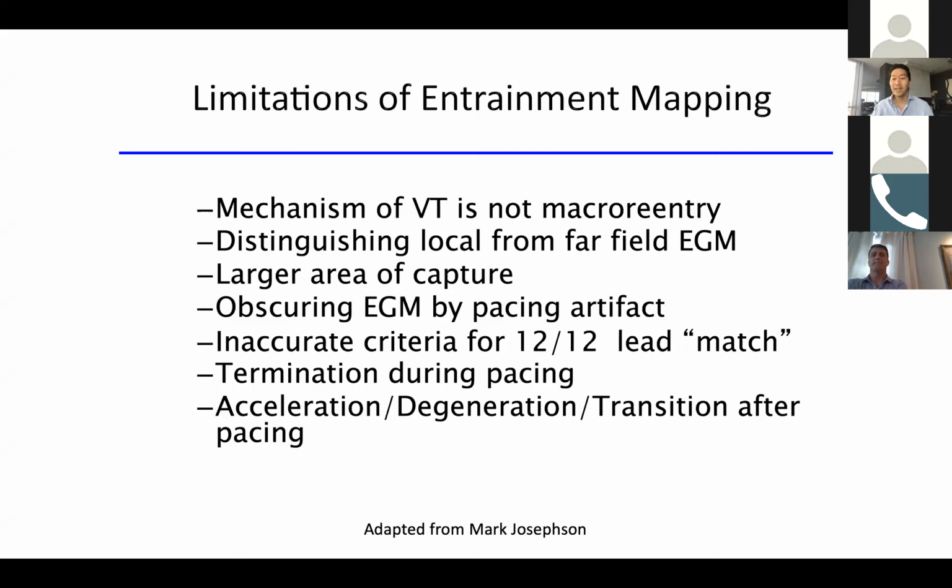In general, we don't typically pace at 2 or 3 mA in scar VT. We usually pace a lot like 10. Sometimes you can't capture. So that's a problem because it's really naive to believe that you are capturing only the local electrogram of your own interest. Oh, I see that little pixel. I'm going to dial up that pacing and capture only that. I don't think anyone's that good. And when you're pacing at high output, you're capturing much more than just the local potential of interest. And I'm going to show you evidence of that with multi-electrodes.